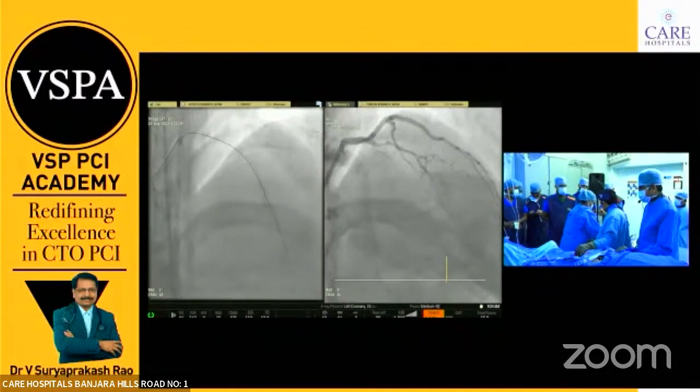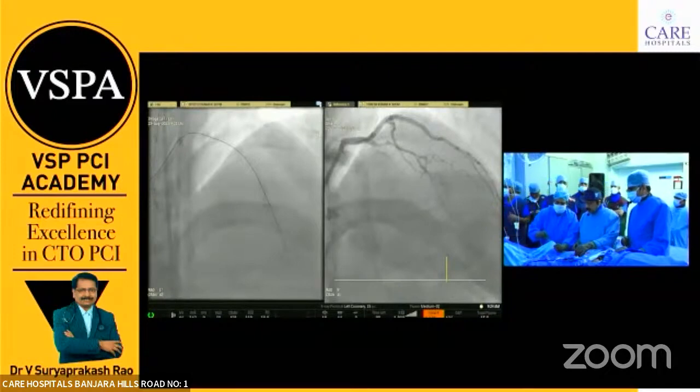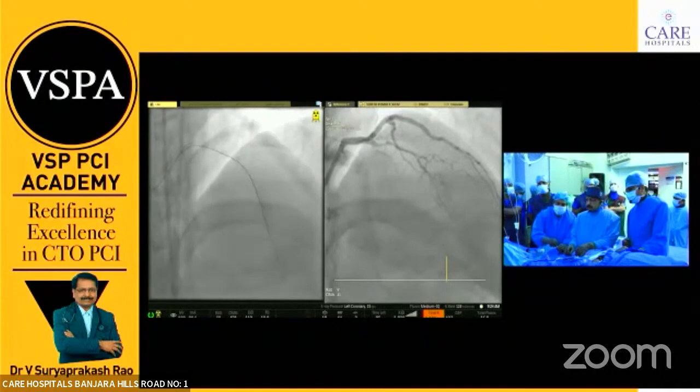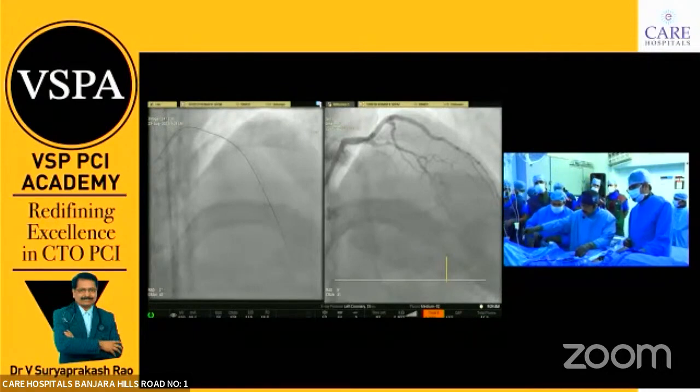How to replace this? Again, put the trapping balloon, which is already there. So we inflate the balloon to 14 atmospheres again and thread the Carvel.